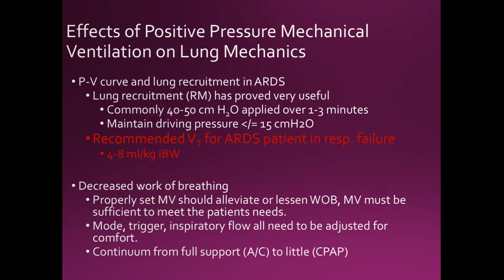Now, remember, this falls under the patient's baseline. Baseline is plus 5 on PEEP, but they're auto-PEEPing at 8. So their baseline as of this moment is 8. To correct that and decrease the work of breathing, you'll set your sensitivity to 7.